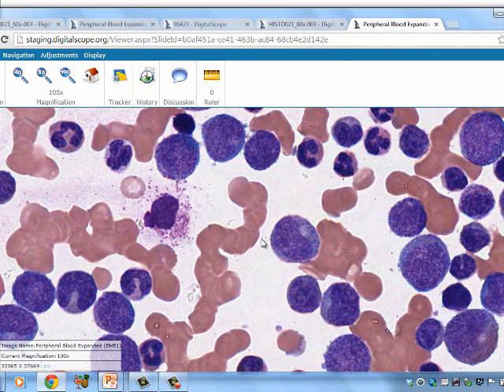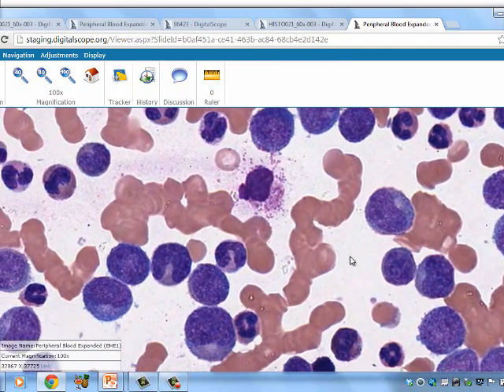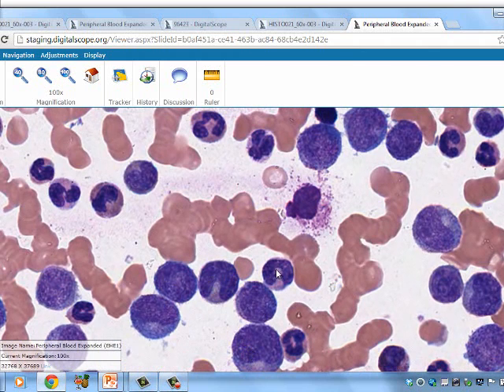So this is possibly a leukemic patient that has a neutrophilic myelocytic leukemia. And here we can see different phases from here, there, and then there. That would be a developmental phase.